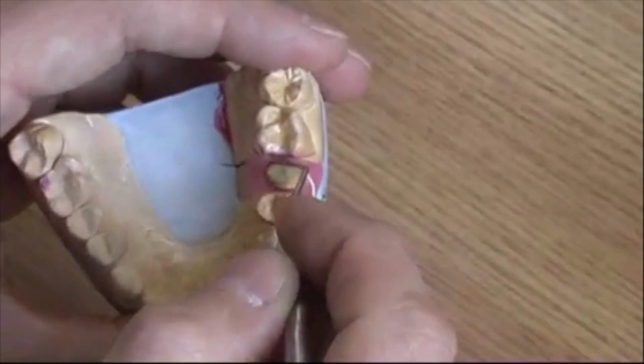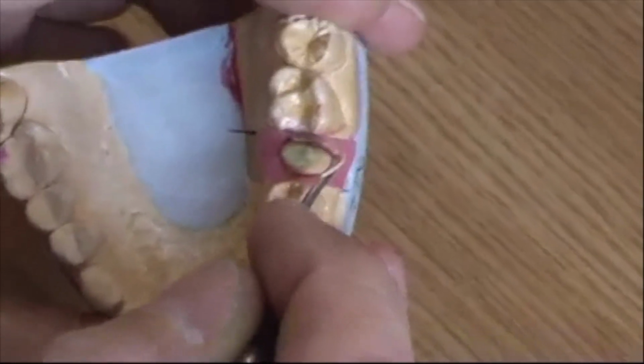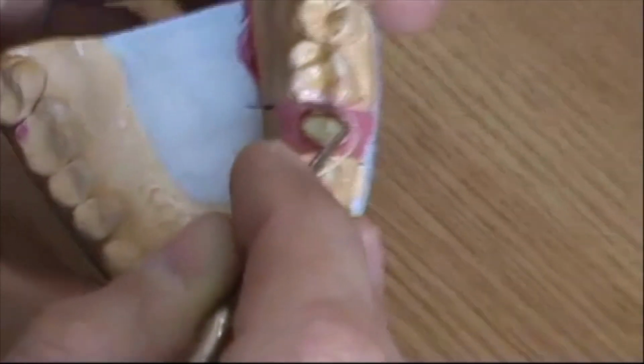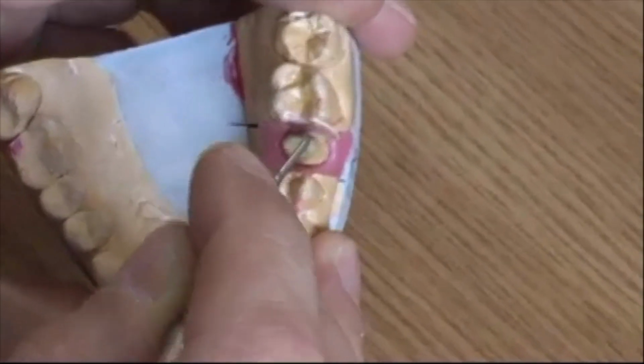And now we take the impression, because we want to send the impression to the lab for a better temporary, if the case requires it, or for the final restoration, if everything is okay.